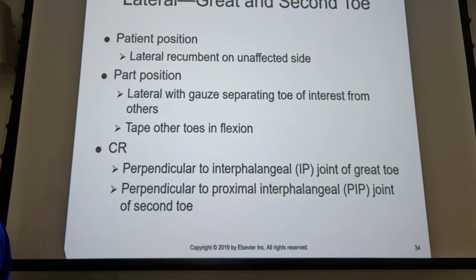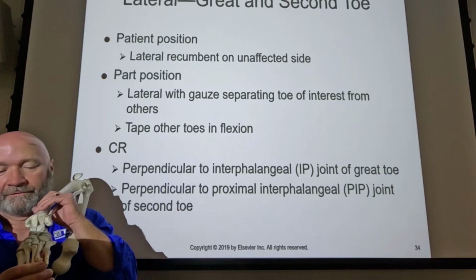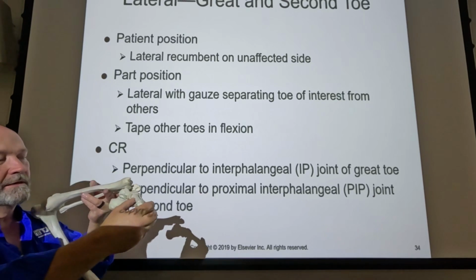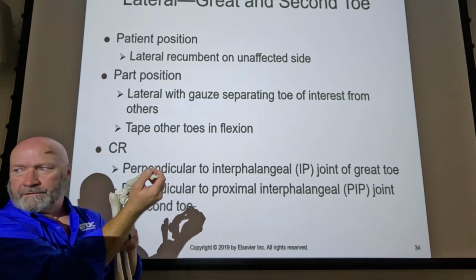So what that might entail is that you give them tape, and you wrap tape around, let's say it's the small toe, or pinky toe, wrap tape around everything else and have them hold and pull the rest of the toes out of the way so they can just see that one toe all by itself.